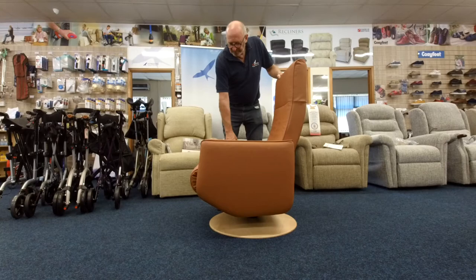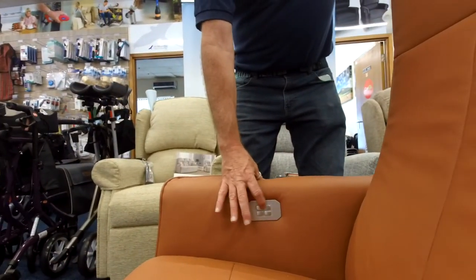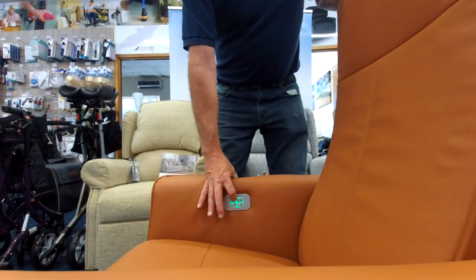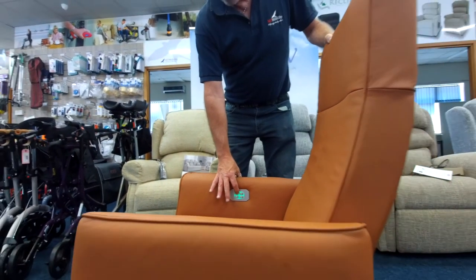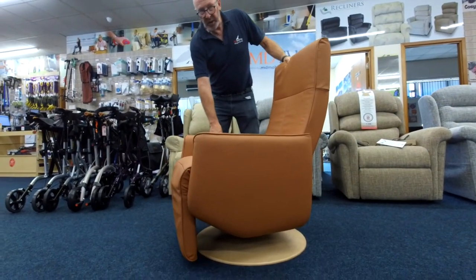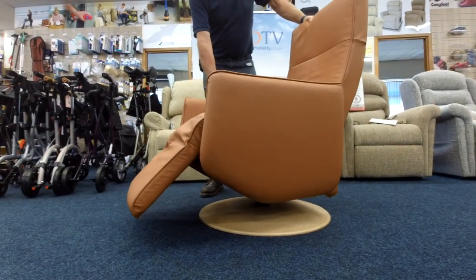I'll just press the button and see what happens — I keep moving to something else. Now, as you know this didn't appear to have a footstool with it, but as you can see it's suddenly starting to appear from underneath. That's quite a nice unique feature.